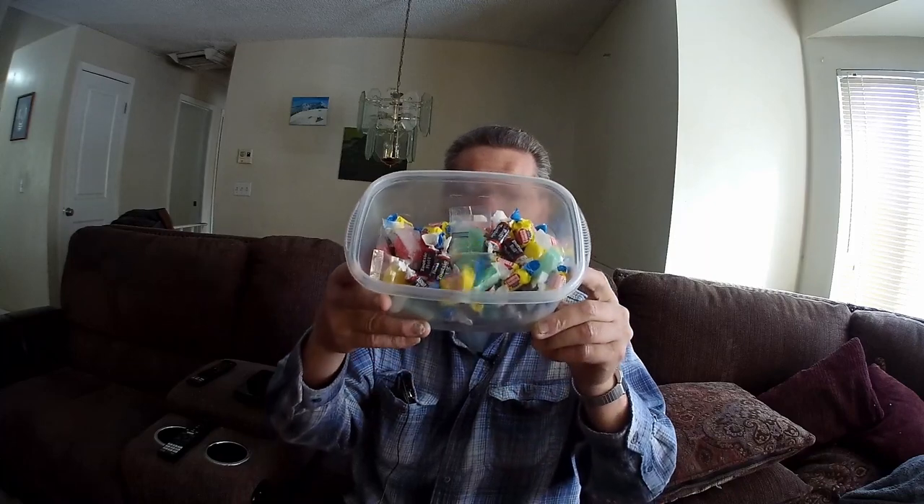Hello, my friends, and welcome back to Dentures vs. Food, where I try to teach you how to eat with your dentures. Now, I said I was going to do a video about sticky food, and I have a bowl full of candy here.